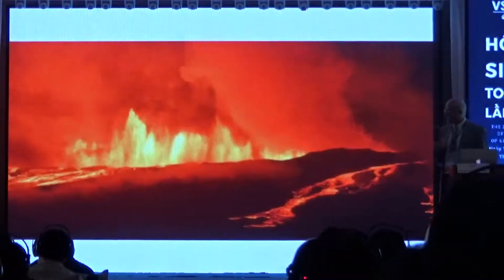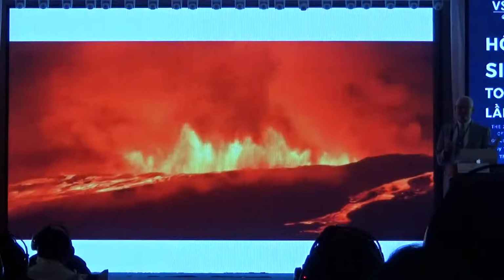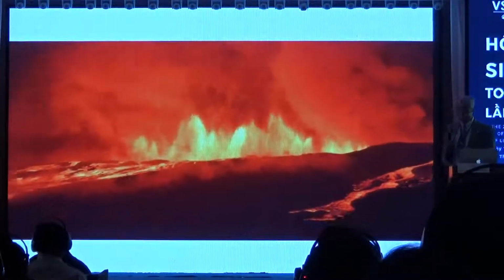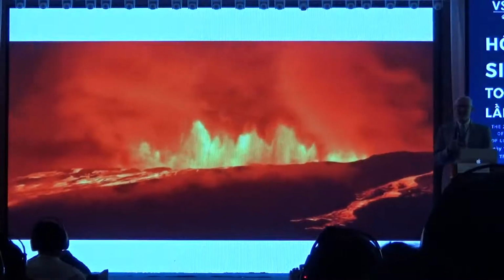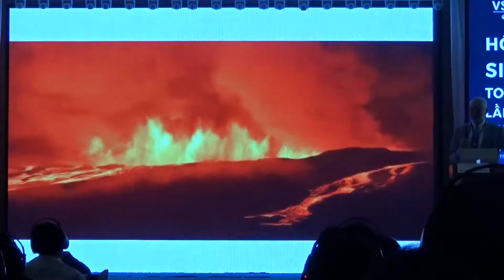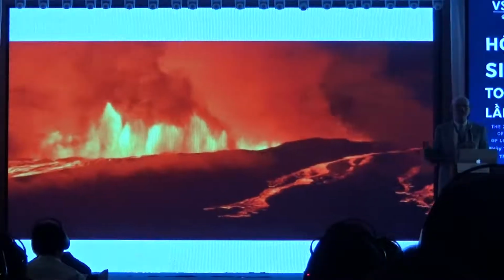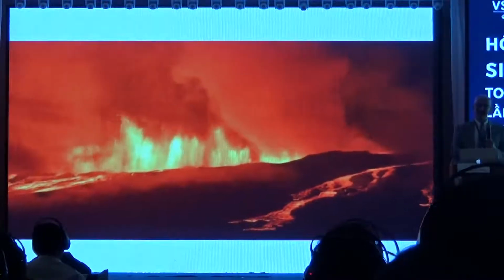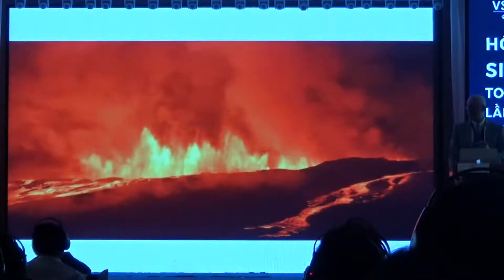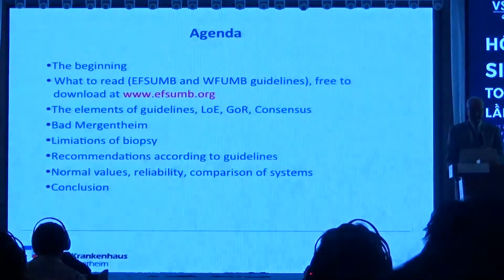We had a meeting all over the world, with Western and Eastern people, and we were very peaceful together, but we couldn't find a solution as to which is the real red for stiff or soft tissue. So please feel free to use a color, but indicate on the left side which scale you used.